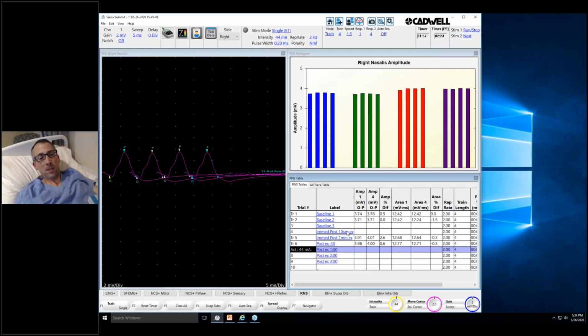So any questions, comments, suggestions? There's one question here. Is this study, there's a slight stimulation artifact. How would you correct the stimulation artifact in this study?